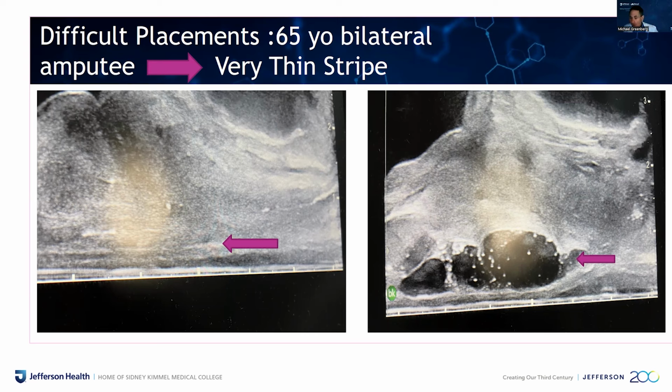And again, this patient was going to be treated in the quickest way, in the stereotactic way, in just 5 fractions. So here, on the other slices, you can see this area where the arrow is pointing to on the slide on the left was a little wider. So here it's very, very thin. So the question is, are we going to be able to get the spacer in?